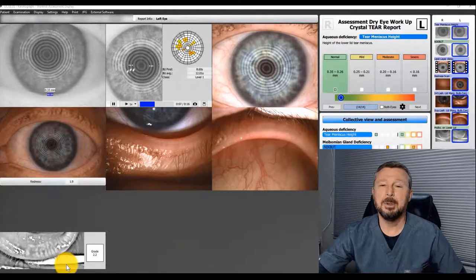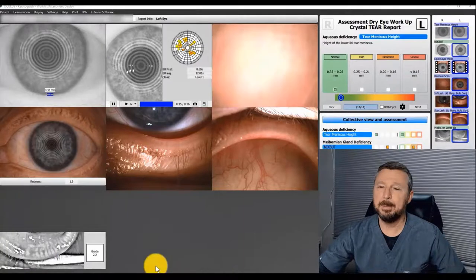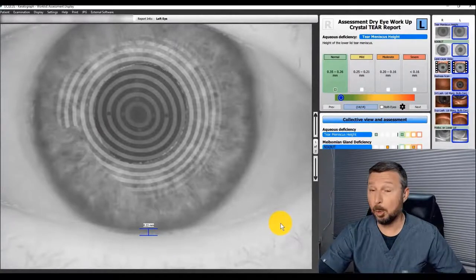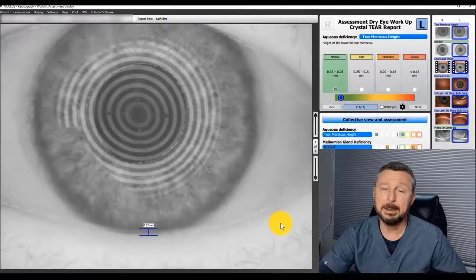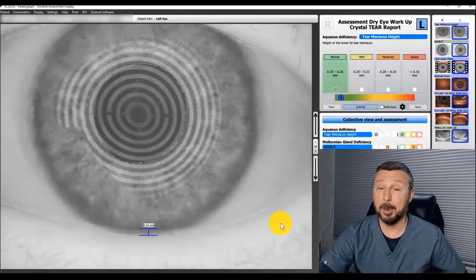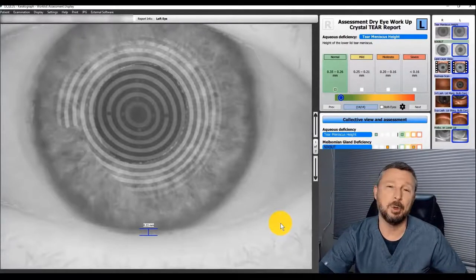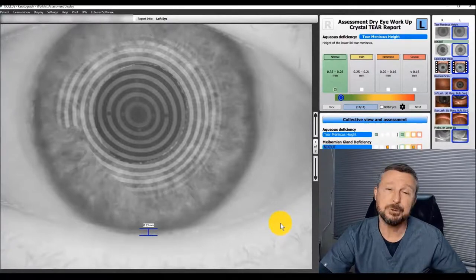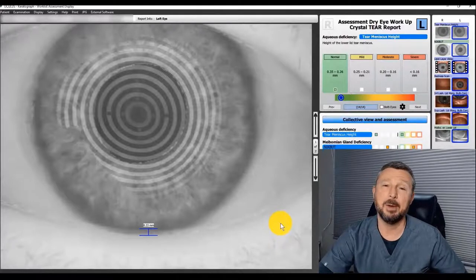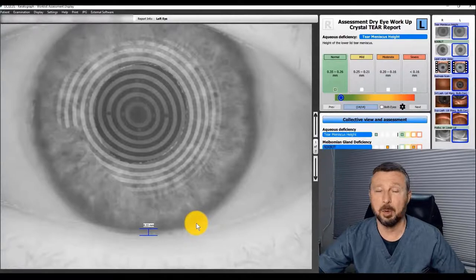Okay, Mr. Patient, let's take a look at the scans of your eyes, starting with your left eye. First, the tear meniscus height. Your lower lid acts like a dam holding a reservoir of tears back against it. The vast majority of dry eye patients have plenty of moisture in their eyes — a great number even have excessive moisture. They think it's crazy when I tell them they too are suffering from dry eye even though they have soaking wet tissue and tears running out of their eyes. It is very rarely a volume issue; it is much more commonly an issue with the quality of the tear film. In your left eye, your tear reservoir is 0.33 millimeters deep — perfectly normal.